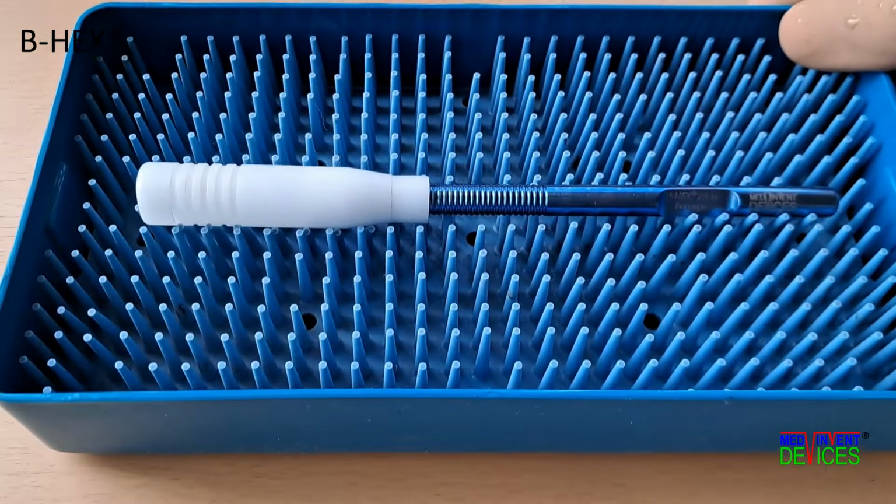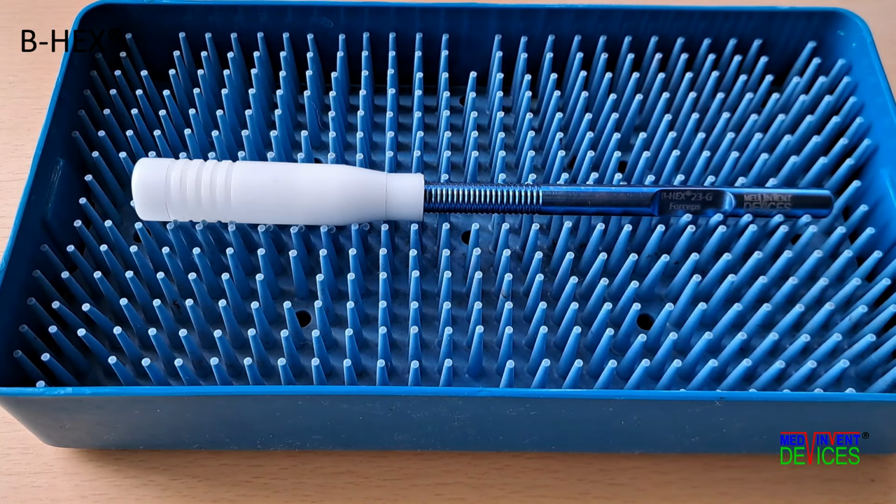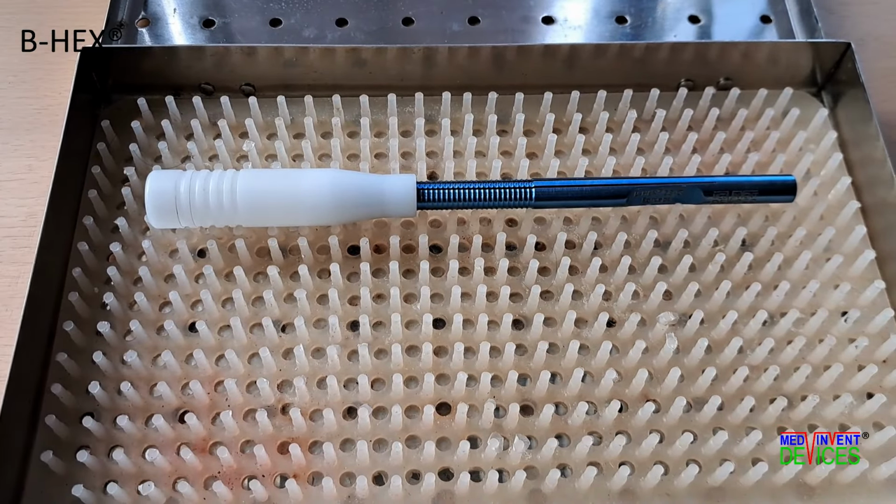The B-HEX forceps is to be capped with the Teflon cap and placed on the silicone mat of the sterilizing tray. It should be separate from other metal instruments and there should be no movement or rubbing against other instruments.